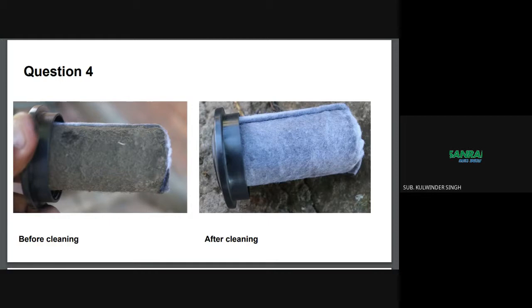For this reason, it is advised not to operate the machine without the intake filter, especially when the environment you are operating in is very dusty, as a fair amount of dust particles will still make their way through the HEPA filter. So the answer is no, it should not be used without the filter. Thank you.